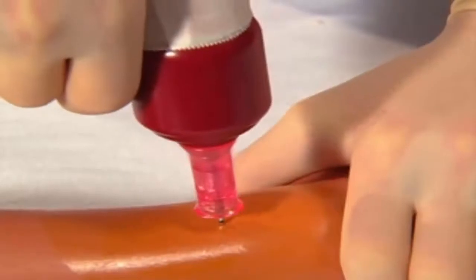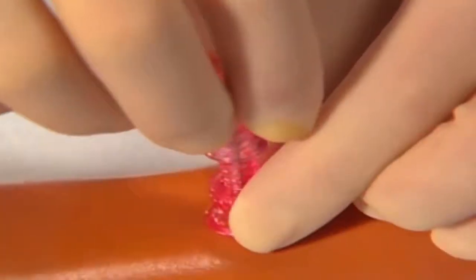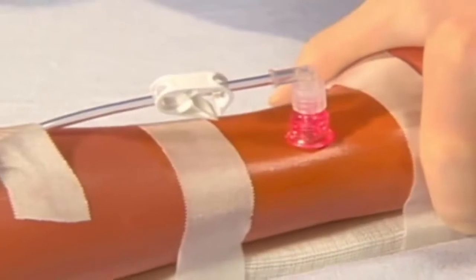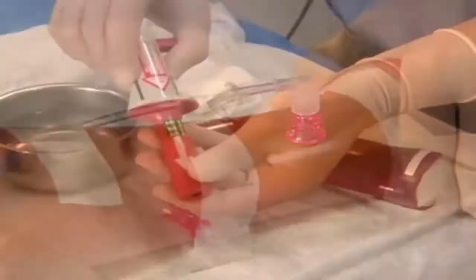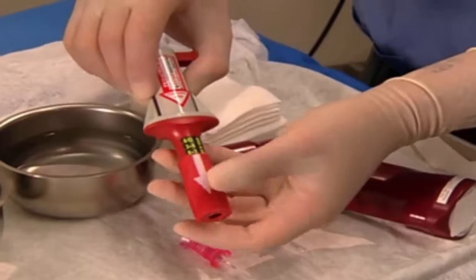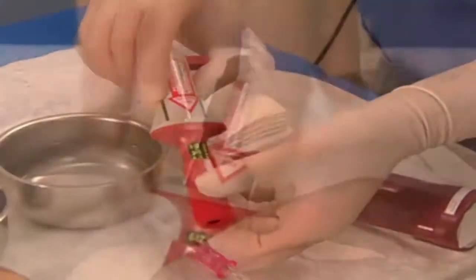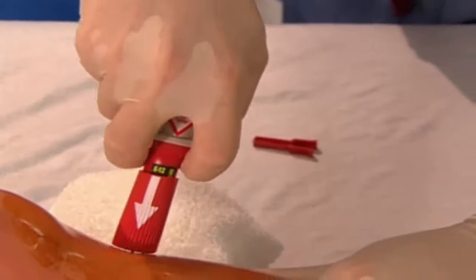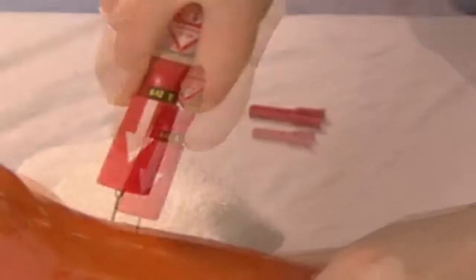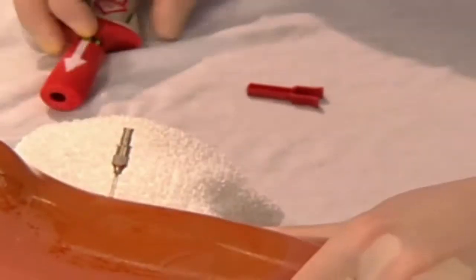Numerous studies show that an intraosseous catheter can be placed more rapidly than a central venous catheter and that this technique is more reliable than venous cut-down. With the introduction and availability of power-assisted devices, which greatly facilitate intraosseous placement, guidelines now support the use of intraosseous access in patients of all ages.